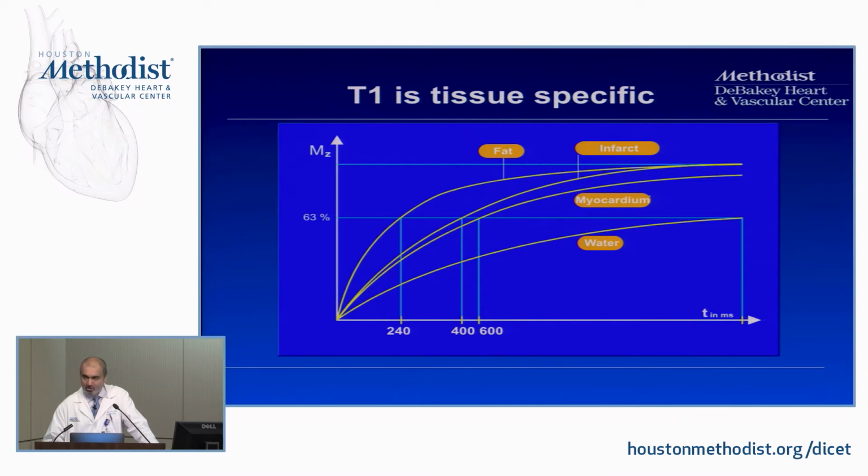And then water, which obviously has the slowest T1 recovery time. As you can see here in this schematic, the amount of time it takes for water to regrow back to 63% is very long, on the order of about a couple of seconds.